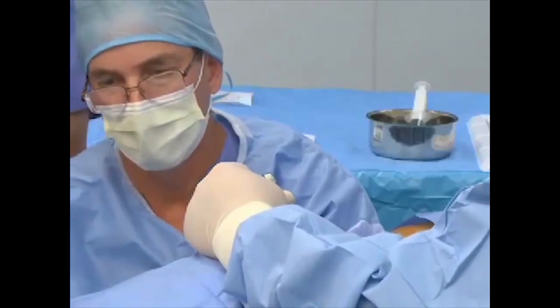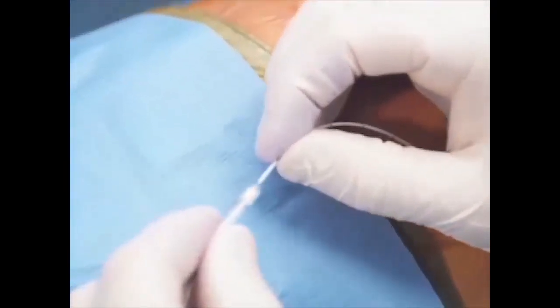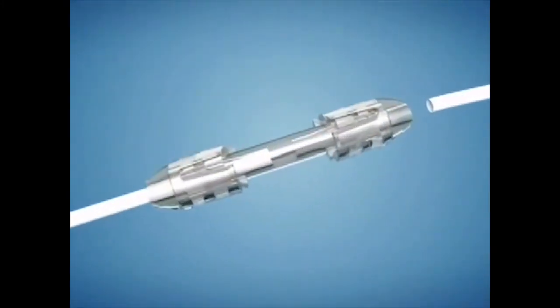Confirm CSF backflow. Then, grasp the center of the catheter connector and insert the end of the spinal segment into the hole of the open collet. Continue inserting the spinal segment until you see the end of the catheter past the collet, and the catheter will not insert any farther.